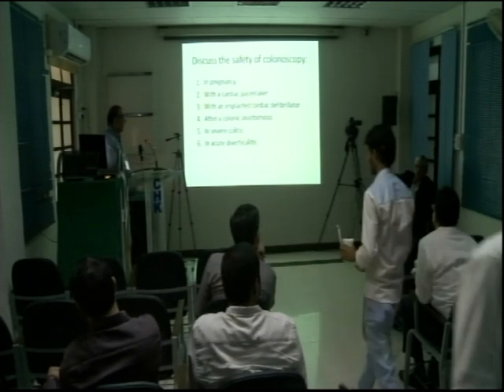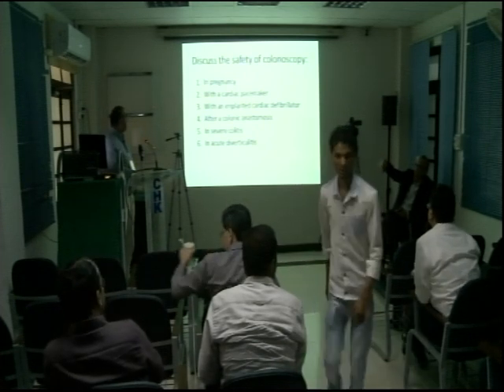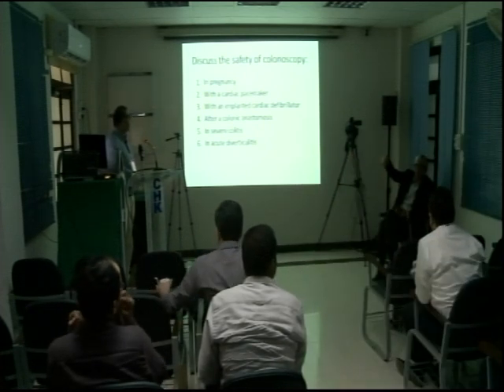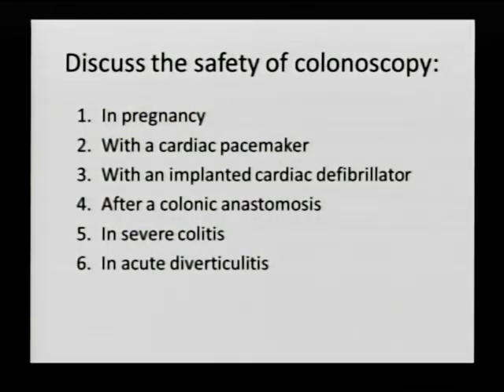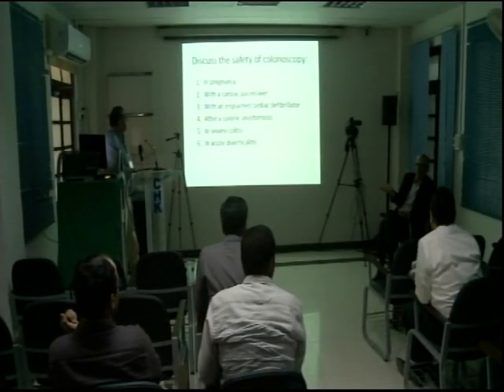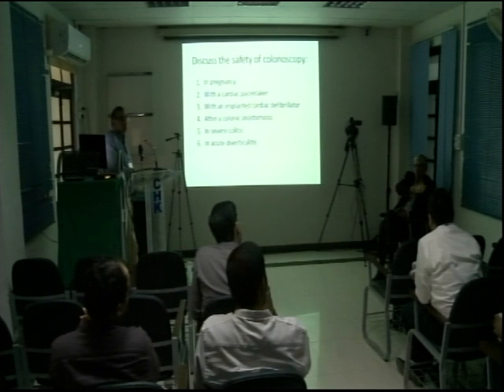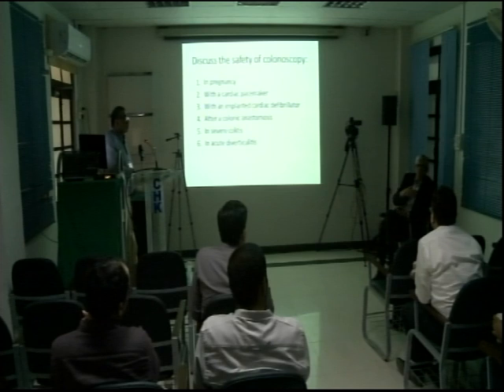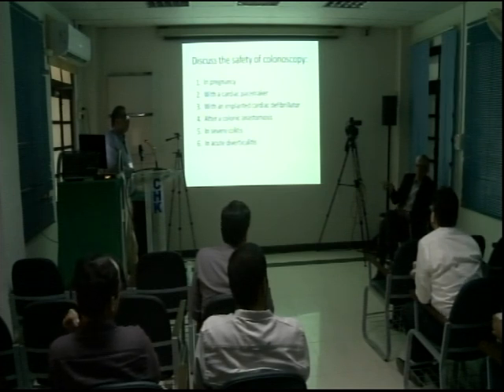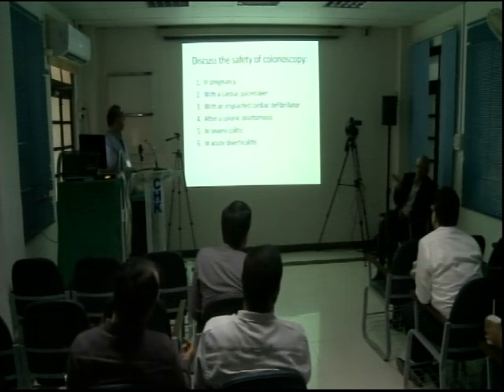This scenario happens quite often with ERCPs. Yes, exactly. So again, my view is simple. I'll get the cardiologist involved. I don't remember anything about pacemakers, I don't even know what types of pacemakers there are, neither do I want to. So I will ask them, I need to do this. The technician comes, does whatever he has to, gives me permission to go and use my electrosurgical unit, and then we go ahead and do it. So the responsibility is not on me.